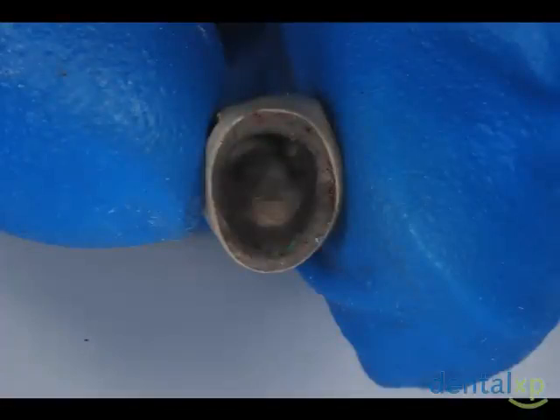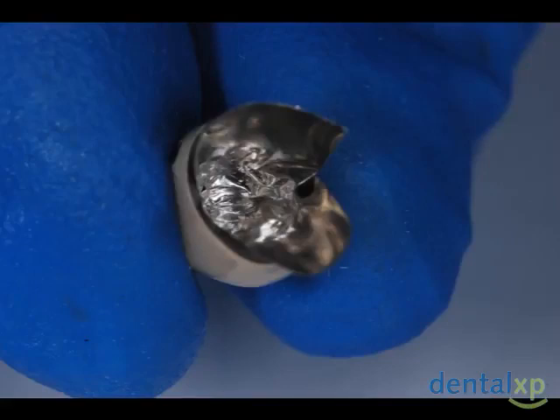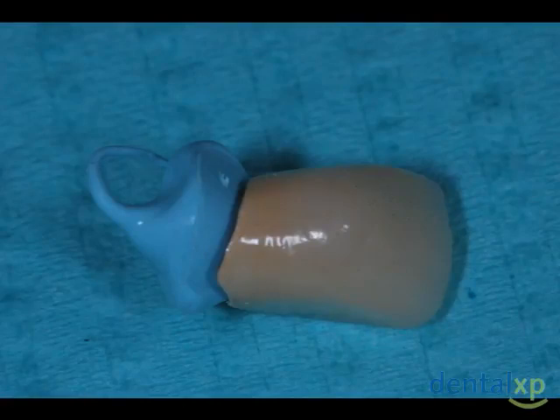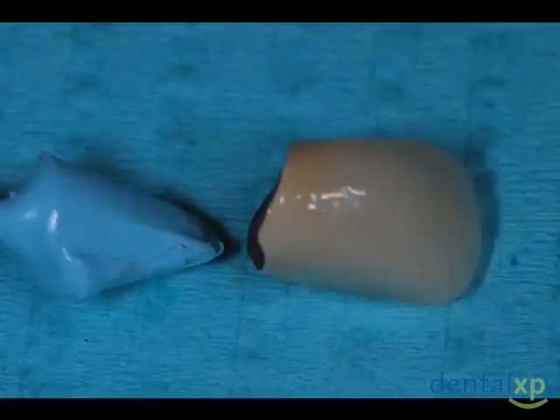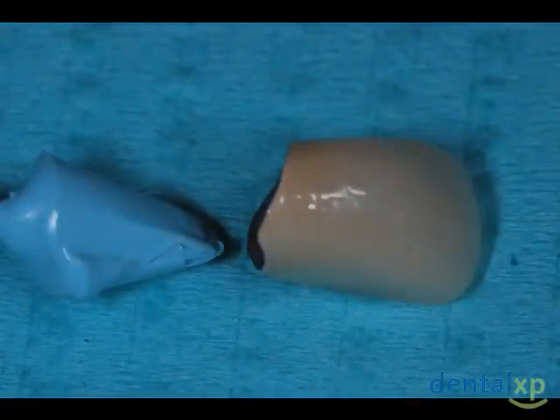On a cemented implant crown, a custom abutment has been fabricated, and then the final restoration has been developed to that custom abutment. Foil is placed into the final restoration to act as a spacer. Then a putty analog is developed for the implant crown. This shows the implant crown and the putty analog.